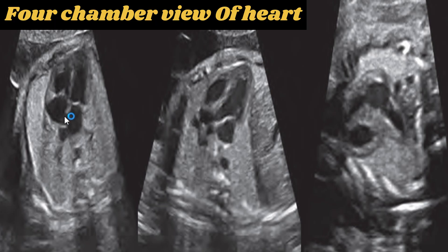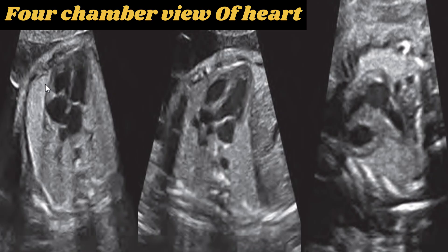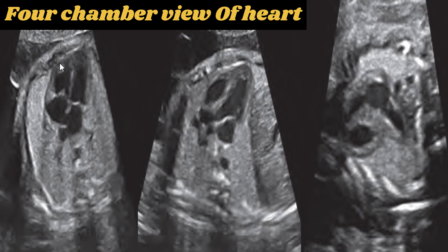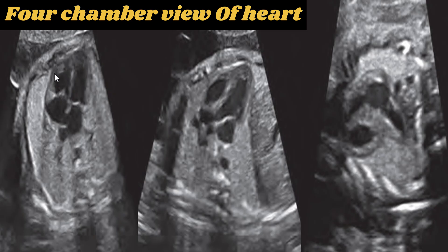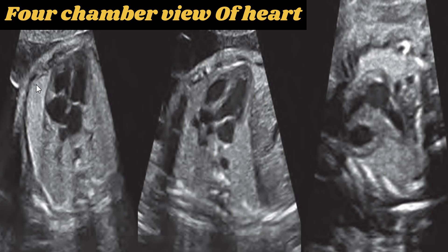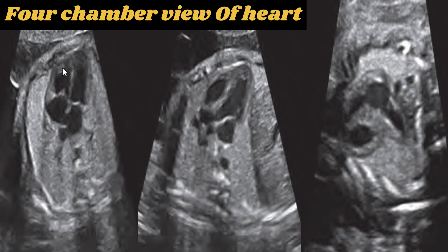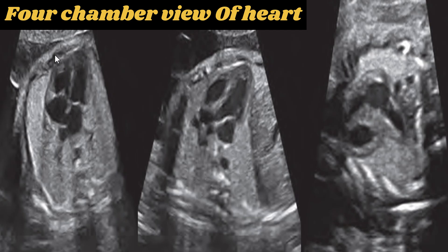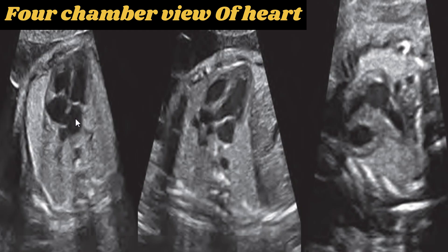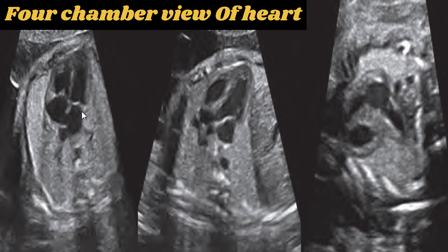Now we are going to discuss the fetal heart anatomy. This axial view of the fetal thorax shows a four-chamber view. The apex of the heart points toward the left anterior chest wall at approximately 45 degrees from the midline. The right ventricle is closest to the anterior chest wall. Also visible are the left ventricle, right atrium, left atrium, and the intra-atrial foramen ovale.